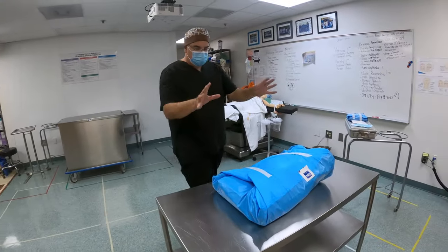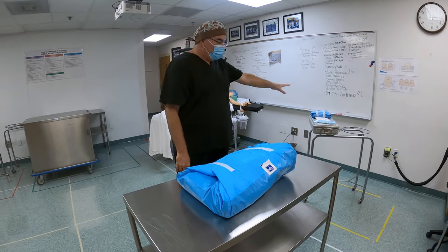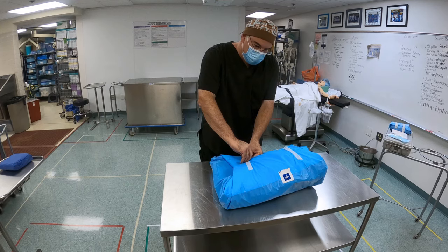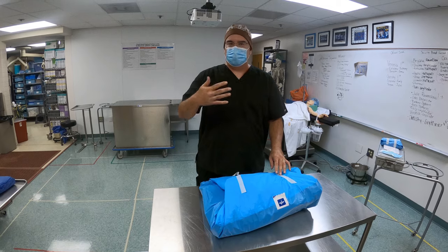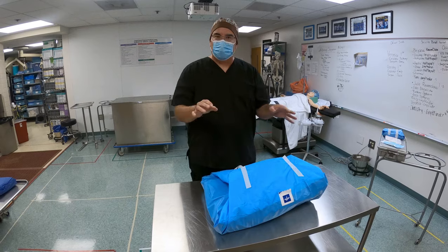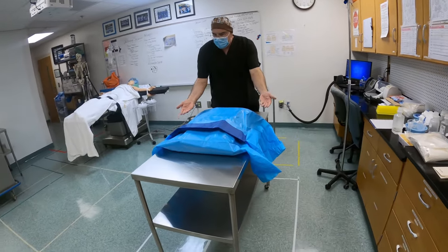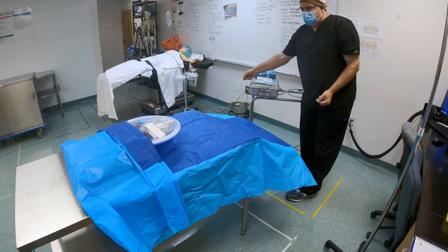Once I have everything set up, something is on all three elements — I've got something on the back table, something on the ring stand, and something on the mayo stand. Now I'm ready to open my pack. First thing I'm going to do is break the tape on the back one, and I'm going to announce to the room: masks up — because this is when you're changing from a semi-restricted to a fully restricted area, and you want everybody to have their masks up and know that you're creating your first sterile field. I'm going to flip away from me, come over to this side, reach in along the sides, grab here, pull backwards, and let it fall straight down.